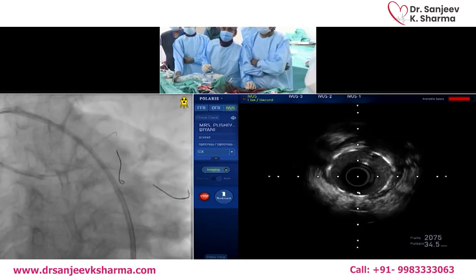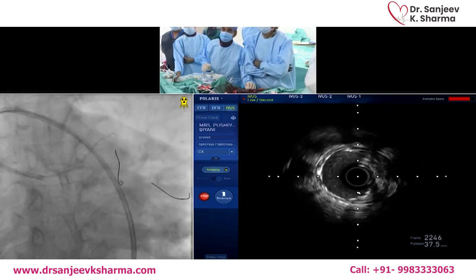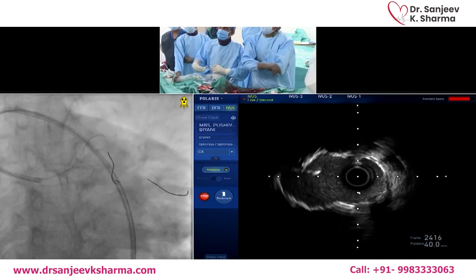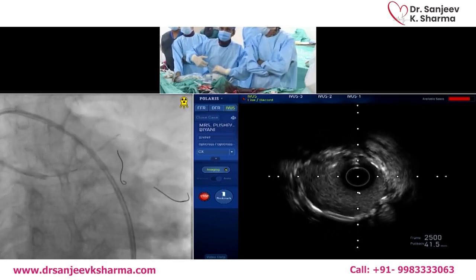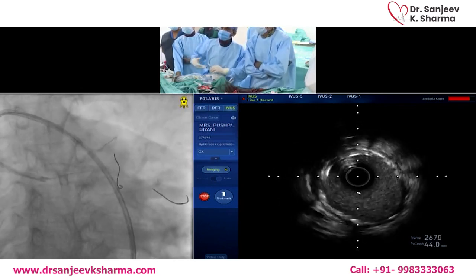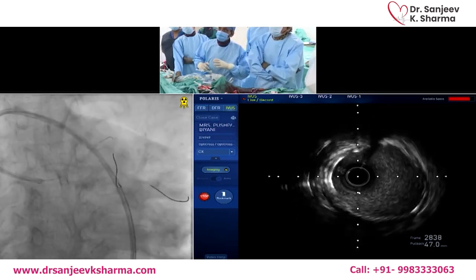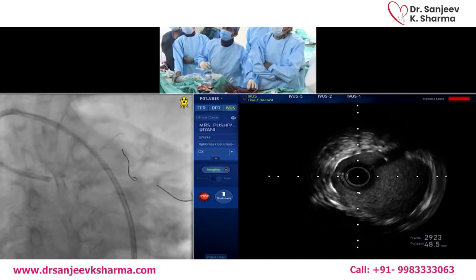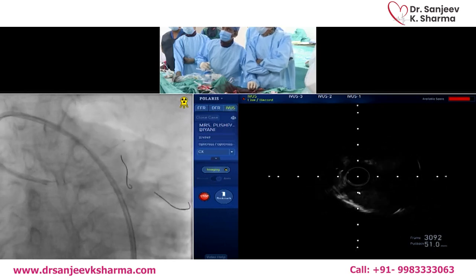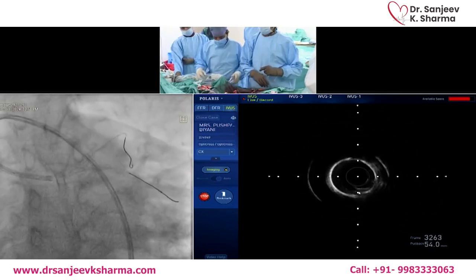You're right, but if we're going to use imaging, we talk so much about it in bifurcation lesions, we should know what we're looking at. And I think to me, now this is the most crucial part. Left main, figure of 8, and looks quite well opened up, distal left main, which was very critical to begin with. There was a calcium 360 degree arc in the distal left main. Now it's nicely apposed. So we need to go with the 4.5 mm balloon. Looks expanded fairly well at the ostioproximal. And see that we are one strut outside, so we are good. We cover the ostium.